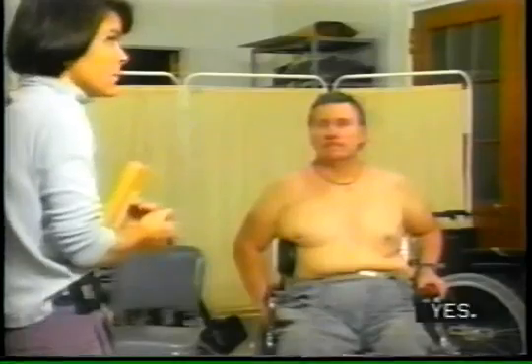So you could, for Steve and I, price out a couple of options and then come back to us with commercial options that we could then decide either A, to try, or B, see what we can get for the money. Yes.